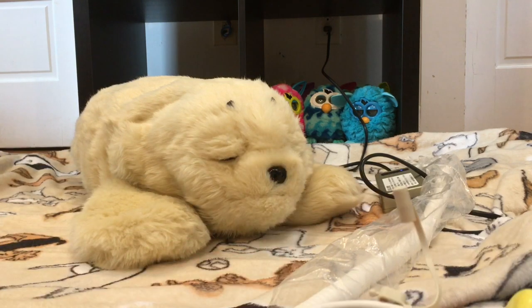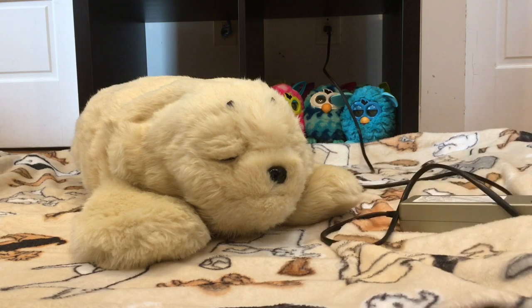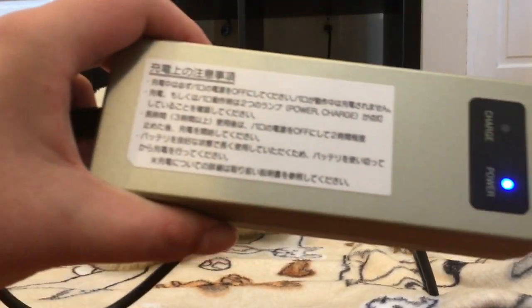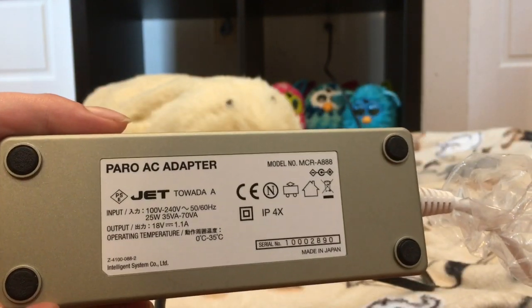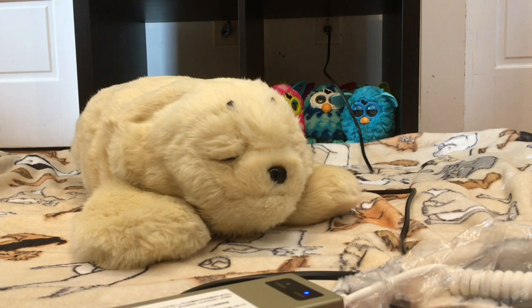The charger that I have right here is actually a universal charger that will work in both the US and Japan and basically any other country. It is 100 volt to 240 volt input, which means it's completely universal. But not all PARO chargers are universal. This particular PARO is a generation 9 Japanese PARO, but the generation 8 ones do not have universal chargers. If you purchase a generation 8 PARO from Japan, you will not be able to charge it in the US without a transformer.